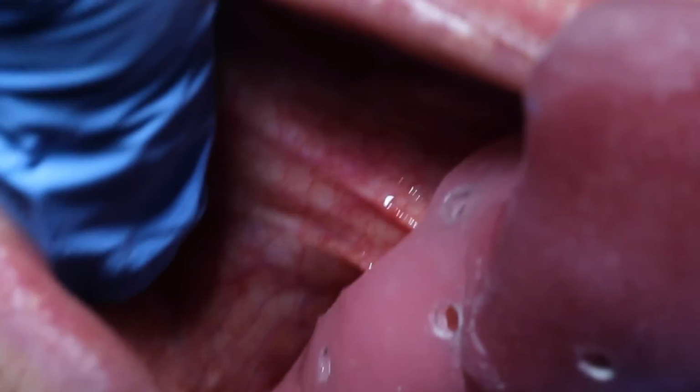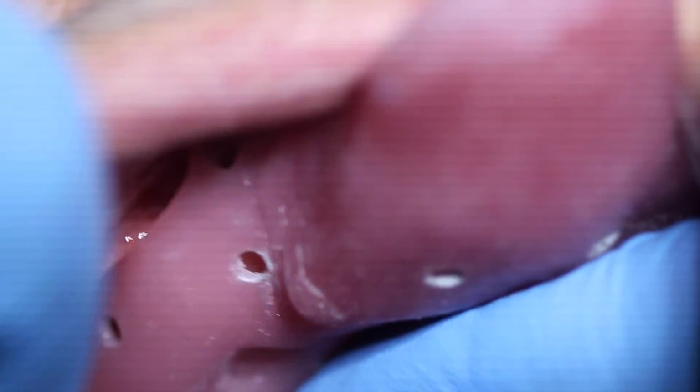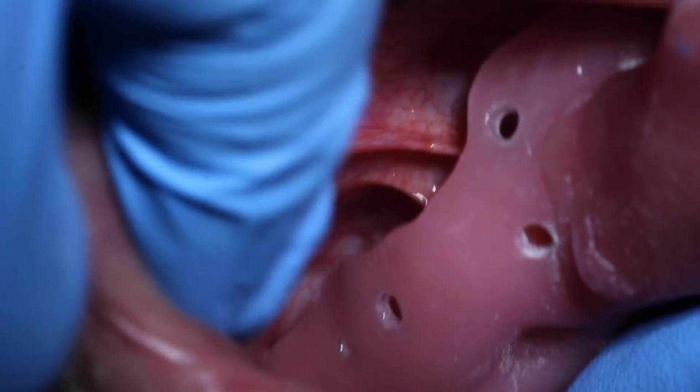Notice how I'm holding my tray with one hand, and I'm using the other hand to try to displace my tray. And right here you can see nicely that it's not being pushed out of the way at all, and that frenum has a lot of space. All right, so I hope that helps. Like I said, I do spend a good amount of time adjusting the custom tray before I border mold and take impressions, because if that's not done right, everything else is going to be wrong.